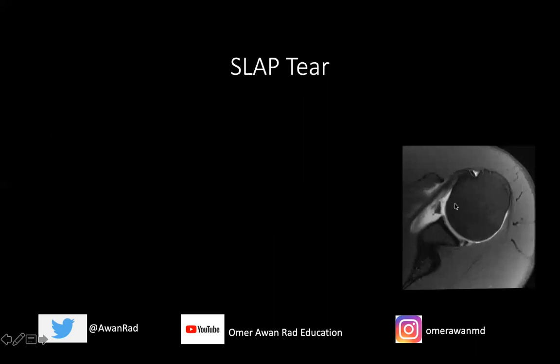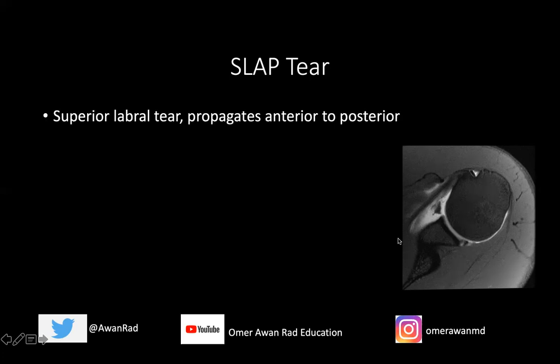This is an axial T1 fat sat image in the same patient through the labrum at the superior level. This is the sublabral foramen I was describing, where the labrum is unattached to the glenoid, creating a contrast cleft between the triangular labrum and the glenoid. You can also see contrast within the posterior labrum in this SLAP tear — bright signal is going into the substance of this triangular dark structure, which is the posterior labrum. The tear propagates in an anterior to posterior direction.